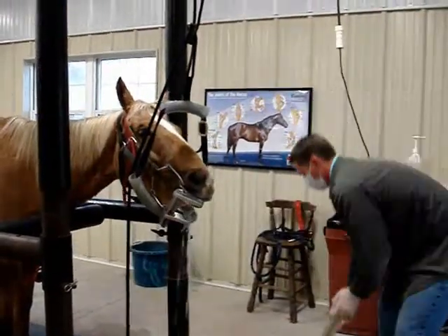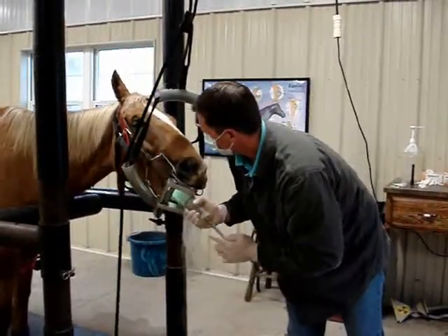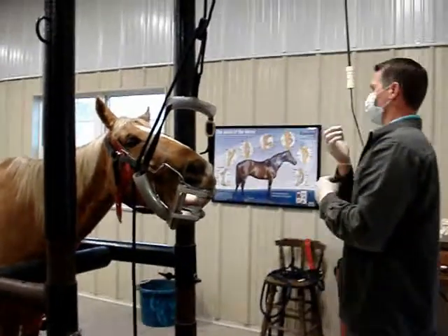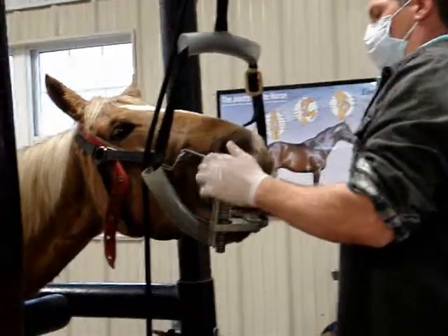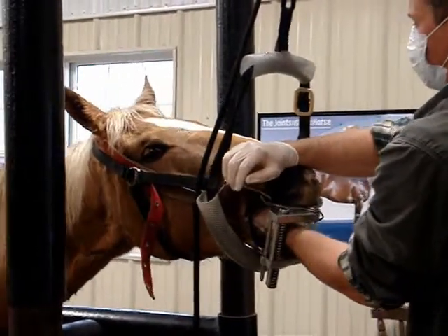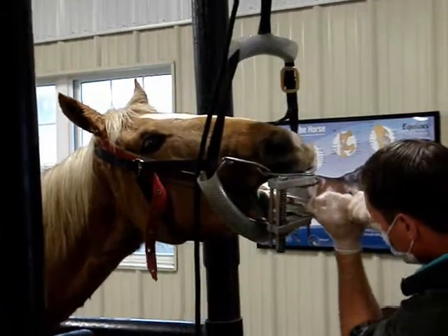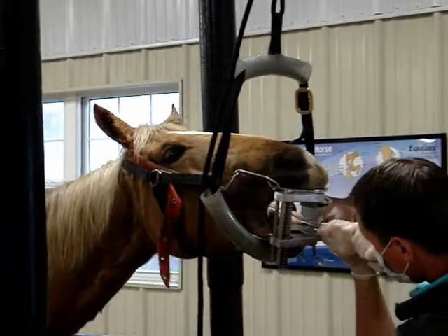We will then rinse the mouth and take another look to see if all needed corrections have been made. Once that is done, the teeth will be felt by hand to see if there are any sharp areas that were missed, and to check for any sharp areas that cannot be seen from the front. This is also a good time to wiggle each and every tooth and to make sure that none are loose. Some horses will have a sharp point on the back side of the upper tooth where the float cannot reach. In this case, we will pass a slim hand float with a special angle to help reach those points.